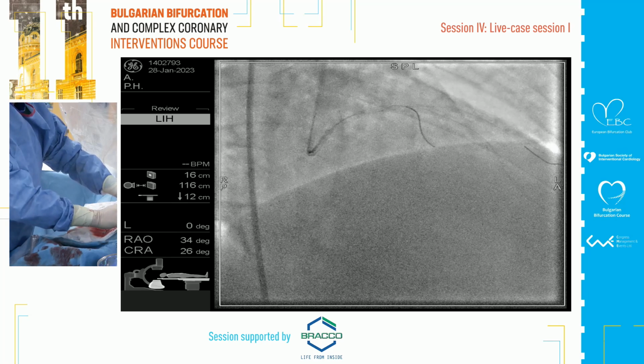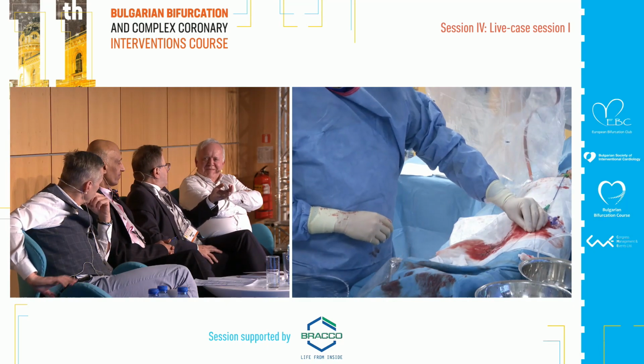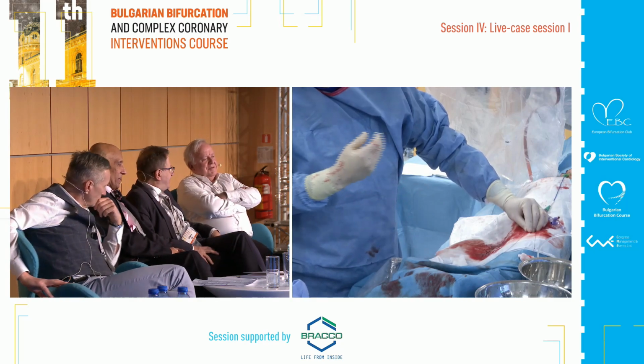I would like to bring your attention to the fact that we change the stent for 30 or 28. The hemodynamic stability of this patient is stable, no issue, to make a compromise on this left main stenosis. With the other stent, we need some more length.